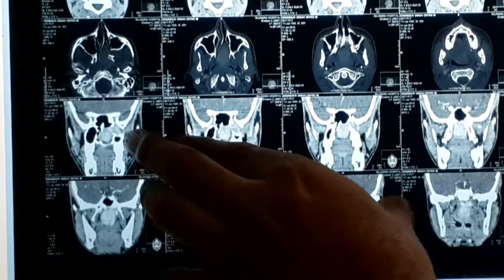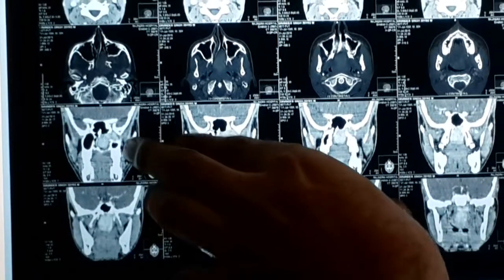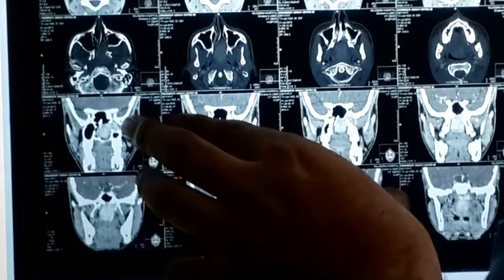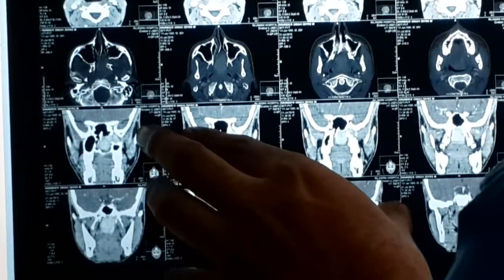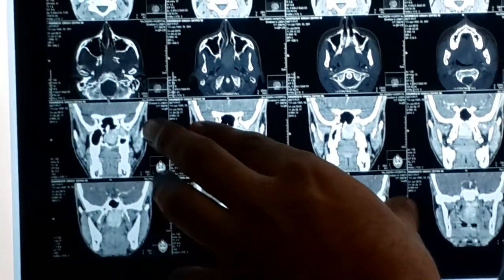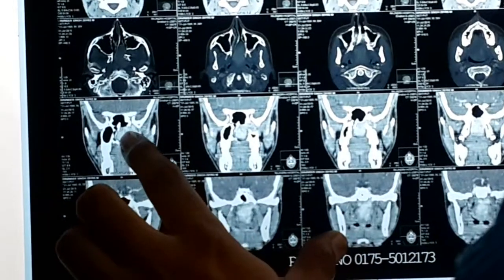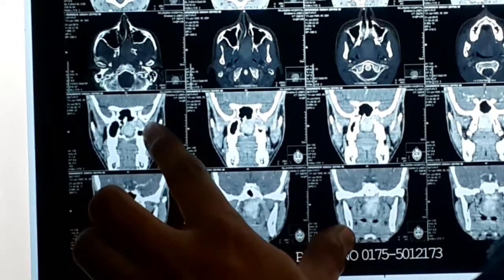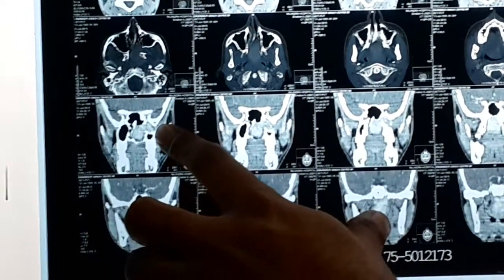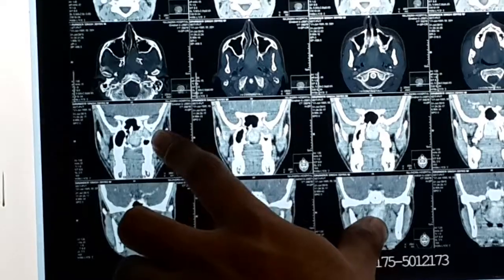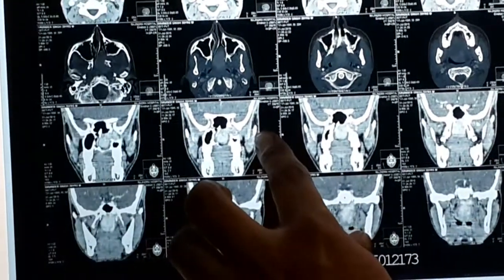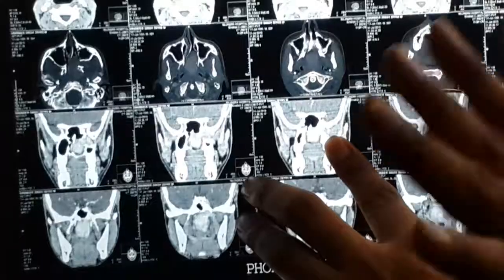This is our lateral limit. See the line of the maxillary antrum — the maxillary antrum. It is not going into the infratemporal fossa at all. Can you see the lateral limit? It is going up to the lateral limit of the pterygoid muscle, but not beyond laterally into the infratemporal fossa. From here it can go into the infratemporal fossa, but this tumor is not going there.